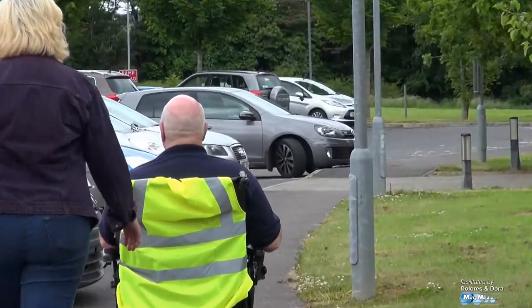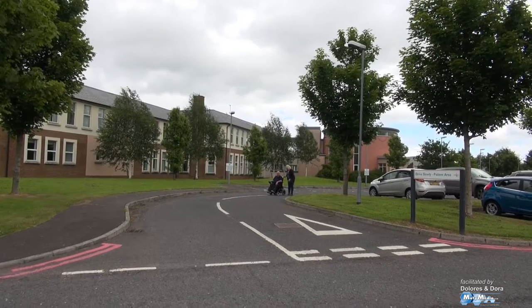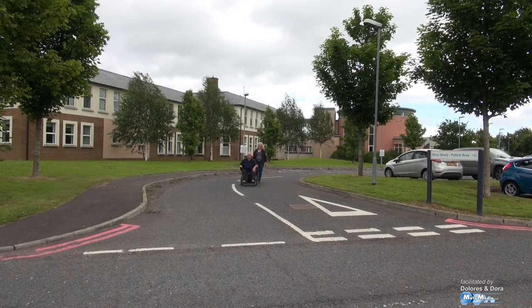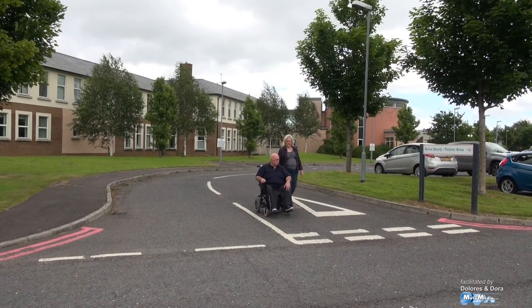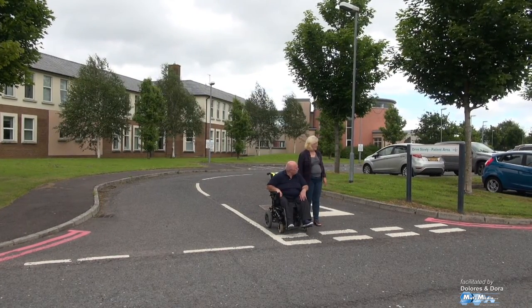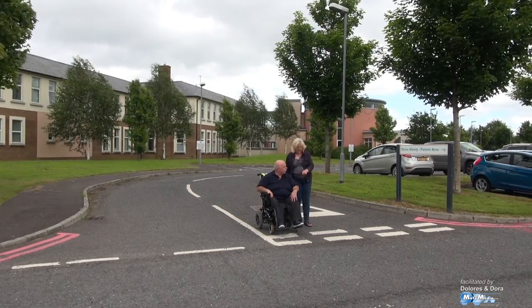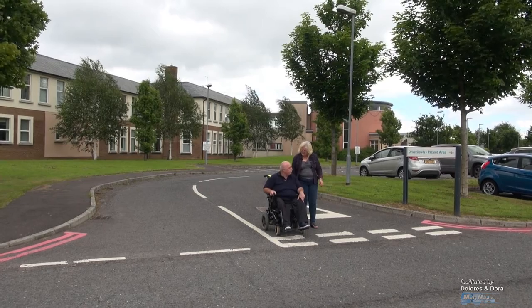When pedestrians are approaching you, please slow down or even stop, because you never know which side they're going to try and walk — you don't want to run into them. David, we're approaching a junction now. Where you need to place yourself is in the middle of the road alongside the central line at the junction. The reason for this is that you need to be visible at all times to a driver approaching behind you. If you're at the side of the road at a junction, unfortunately because you're at a low level they won't be able to see you. So make sure you're in the middle of the road where they can see you. We'll proceed now along the white line and to the junction.